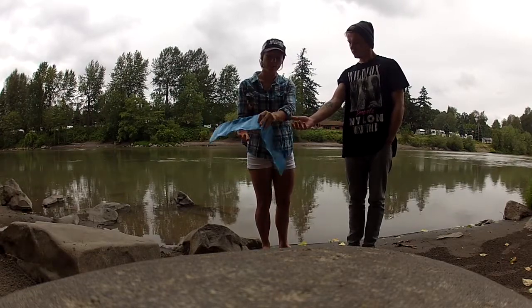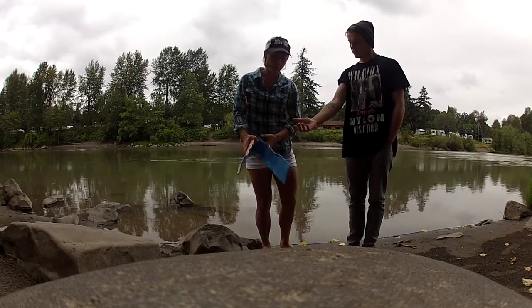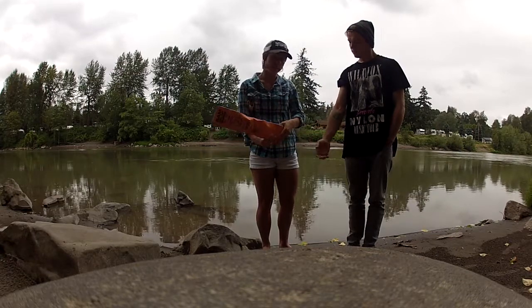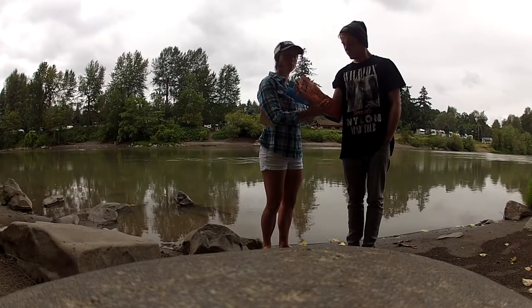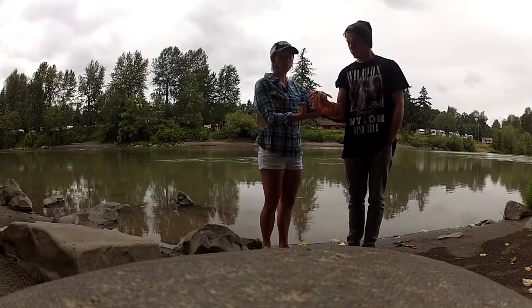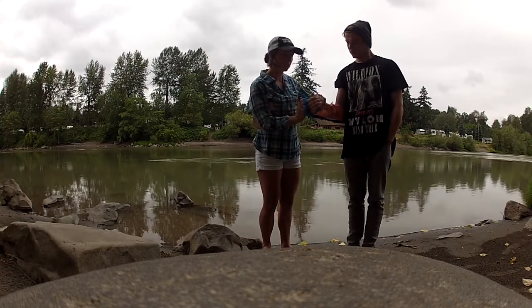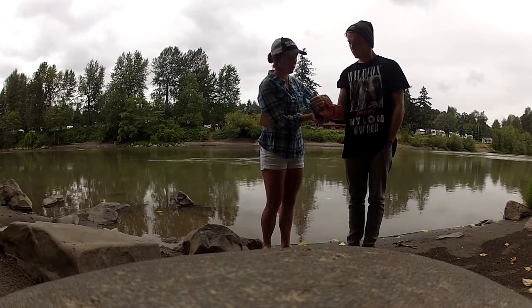There are a couple of ways you can set this up with a SamSplint — I'll show you both. The first way is to form your SamSplint so there's a little pocket for his elbow to sit. That way we're immobilizing the elbow, and the SamSplint goes all the way up to the hand that we also want to immobilize. Then we're going to form the SamSplint to his hand and to his arm.